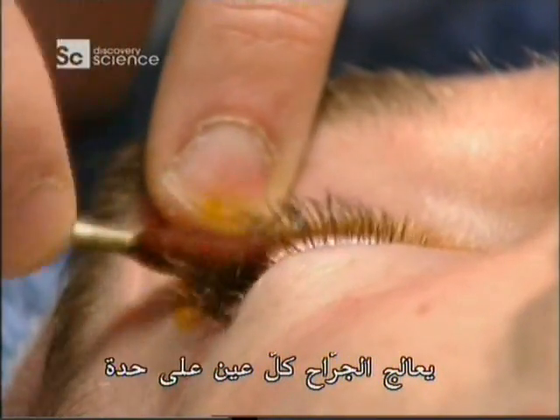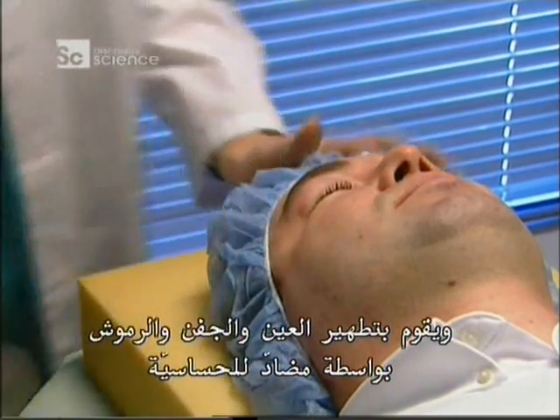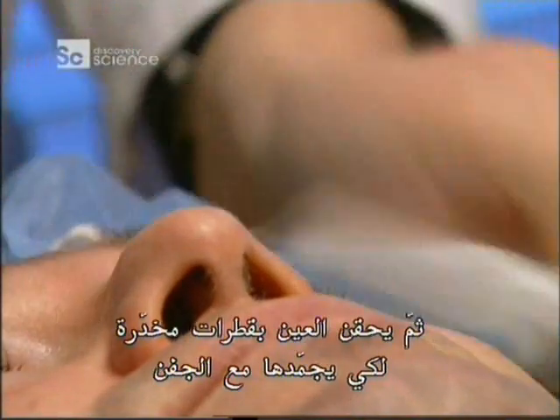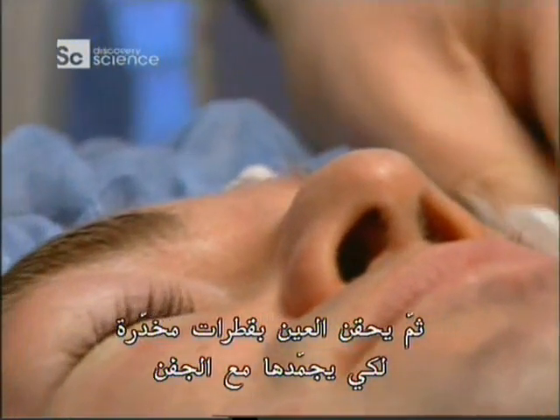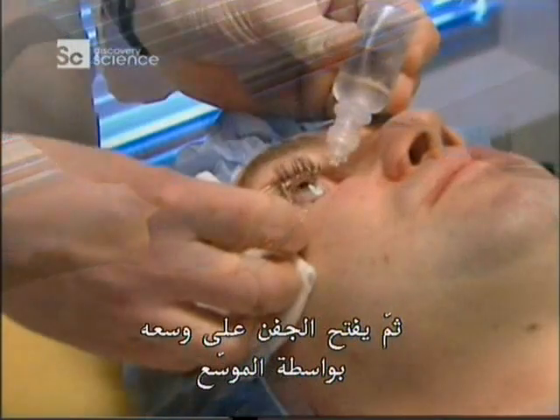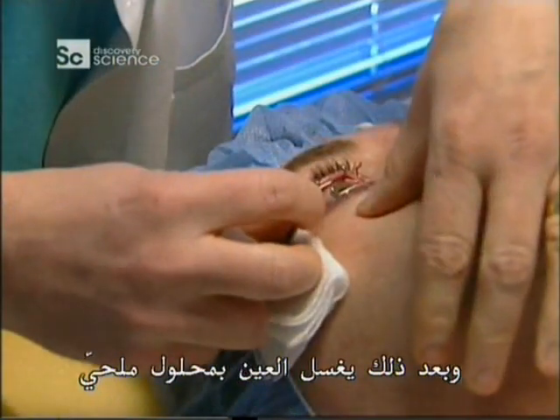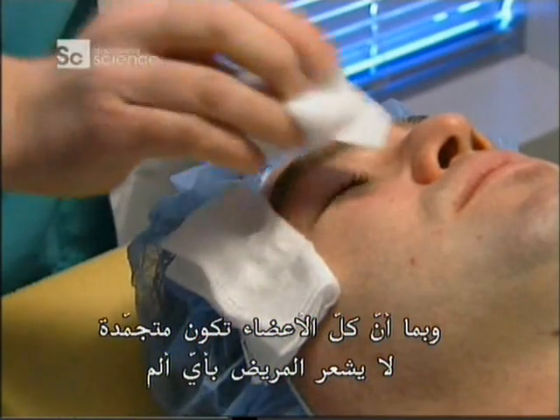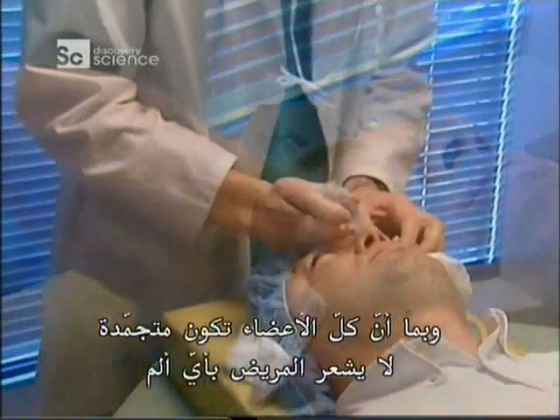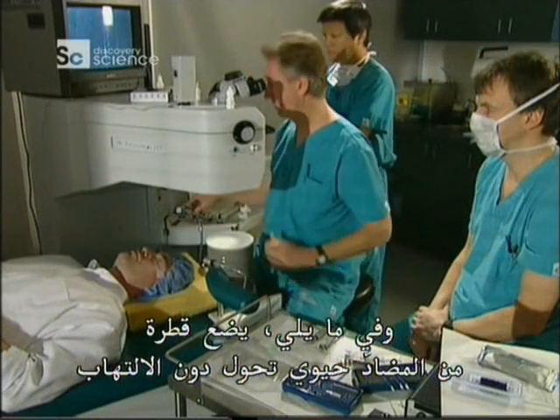The surgeon operates on the eye one at a time. He cleans the eye, the lid and the lashes with antiseptic, and administers anaesthetic drops to freeze the eyelid. He opens the lid wide with a speculum, then rinses the eye with a saline solution. Everything is frozen so the patient doesn't feel a thing. Next, antibiotic drops are applied to prevent infection.